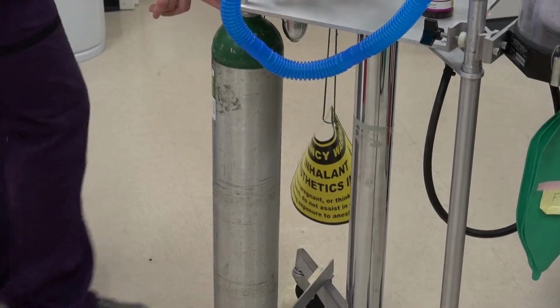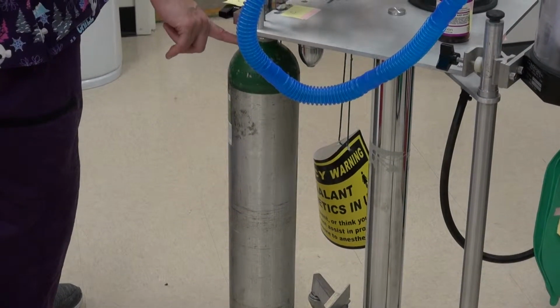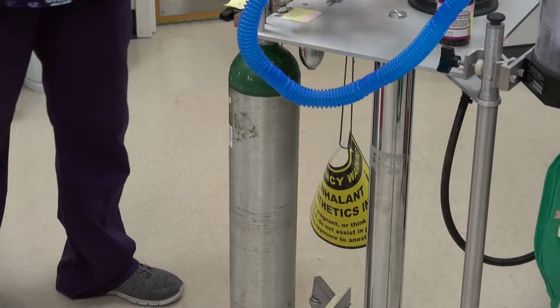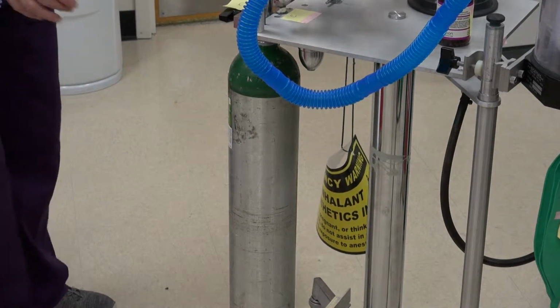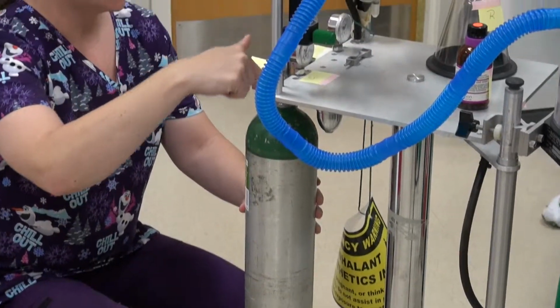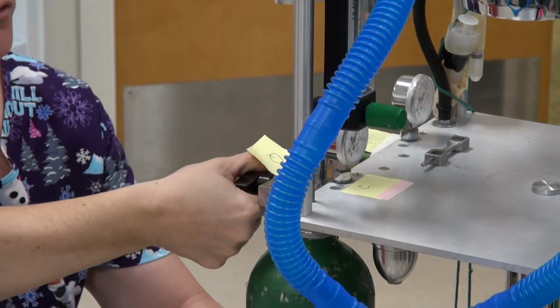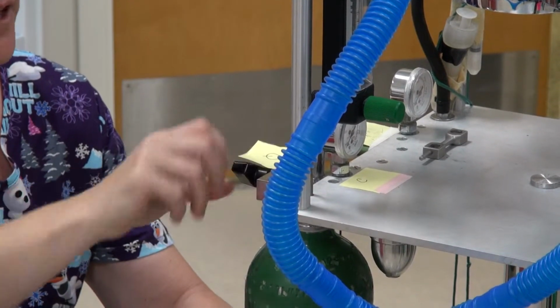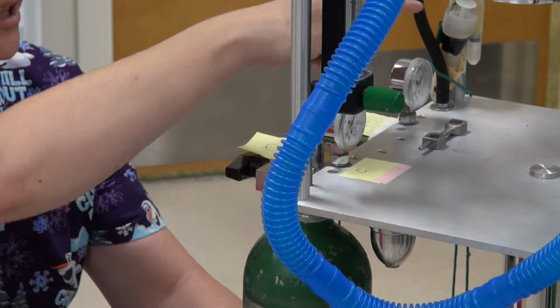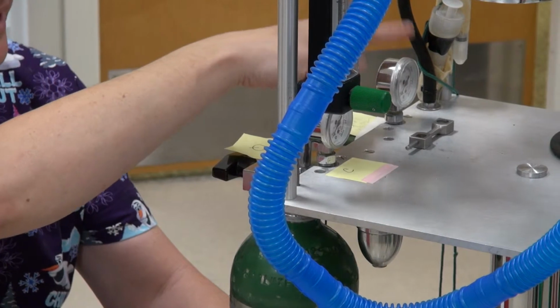What size tank is this? E tank, correct. What are our large tanks called? H tanks, correct. Now, we talked a little bit about our tanks, right? What is this area right here called? The yoke. If I am less than 500 PSI, I need to move my oxygen tank over to here, or I need to open this oxygen tank. I need to add a new tank here.